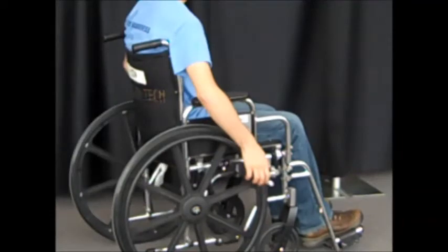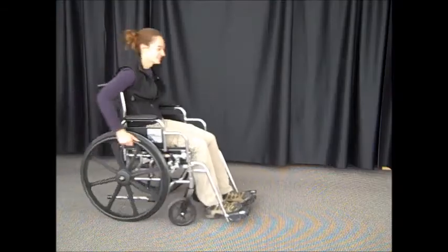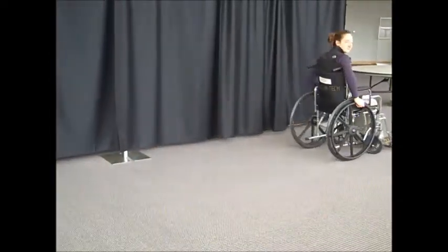Following this, the user returns their hands to the first position. This is called the recovery phase, which uses the posterior deltoids and triceps. Due to the high forces, low propulsion efficiency, and repetitive nature, upper extremity pain and injuries are common.